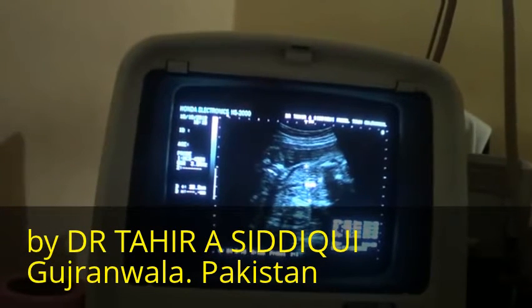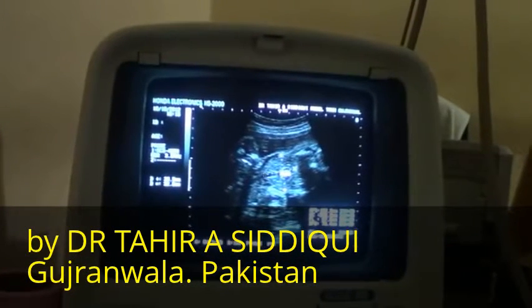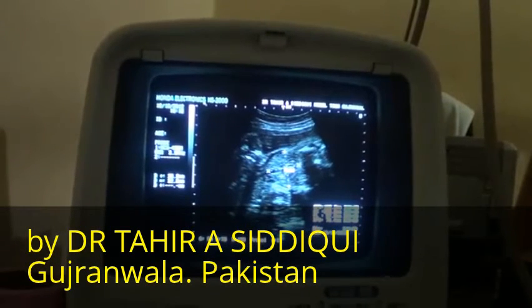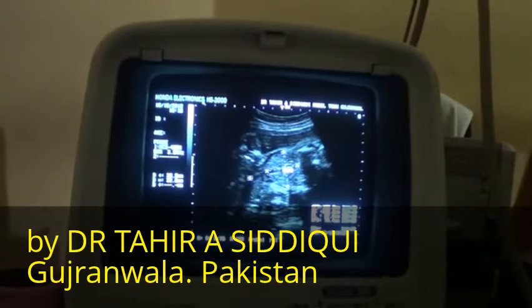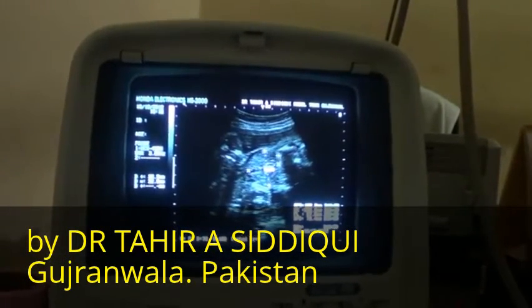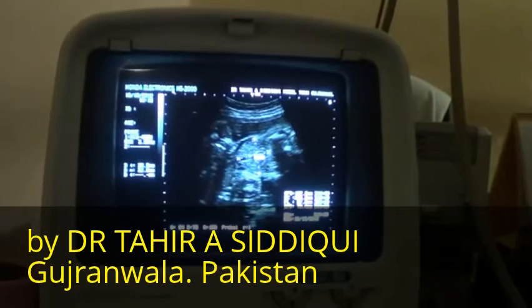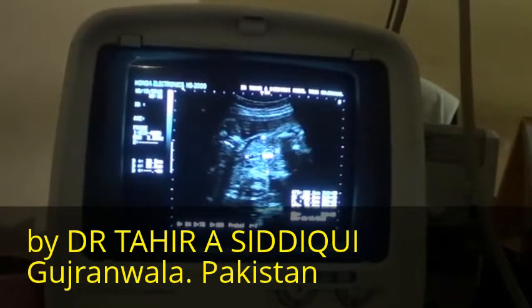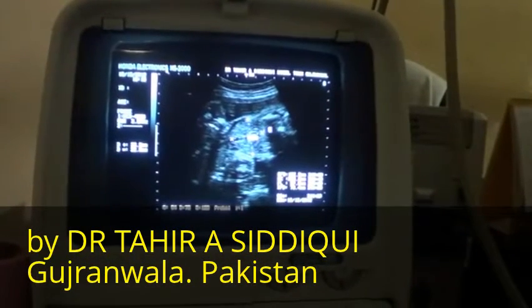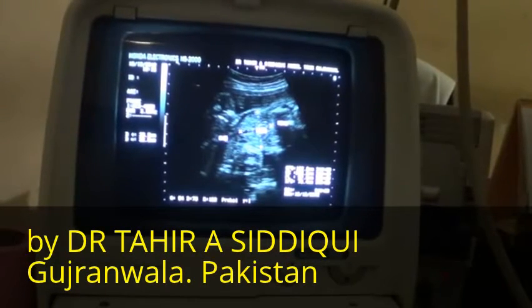Now in the neck region it measures approximately 36 by 32 millimeters, or 3.6 by 3.2 centimeters, with this vessel being the superior vena cava most probably, and this is the covering of this mass, solid, evenly echogenic. There is a covering around it, with this being the head of the fetus, and this being the chest or thorax.